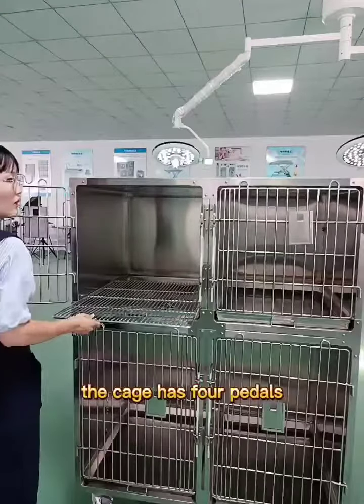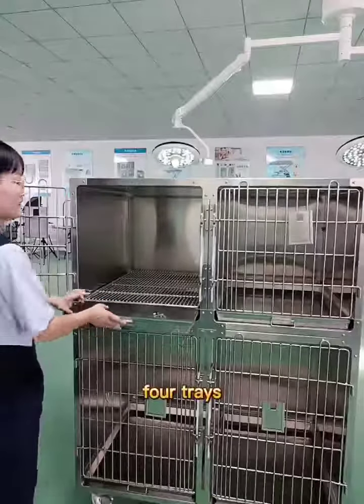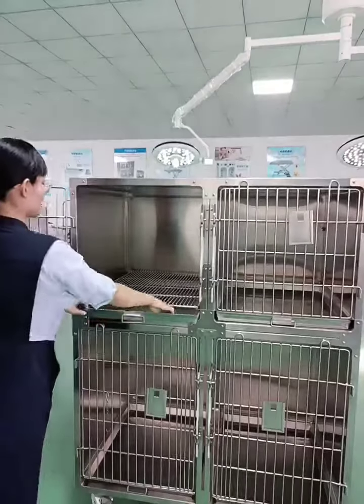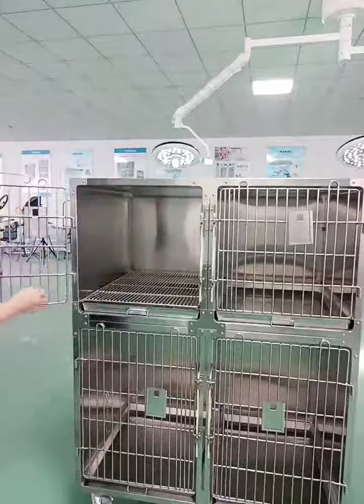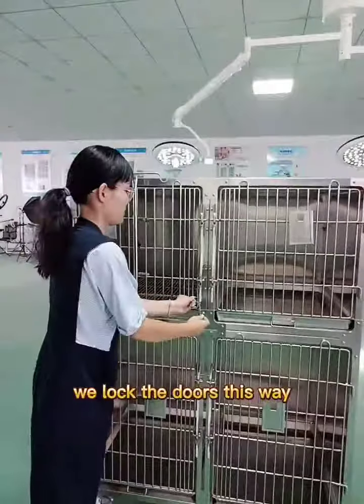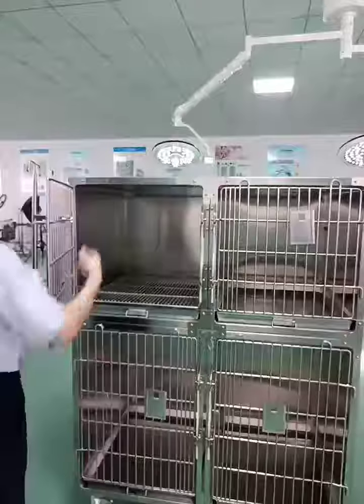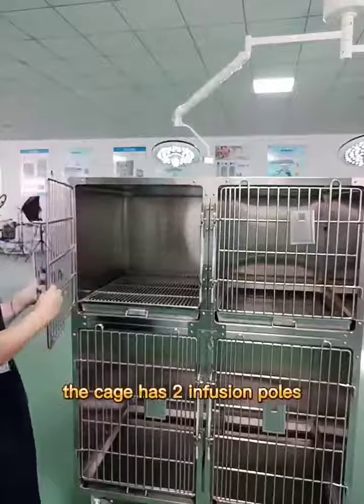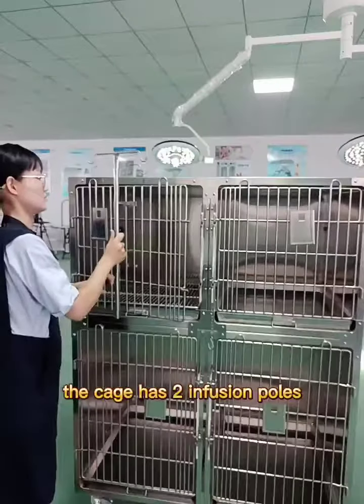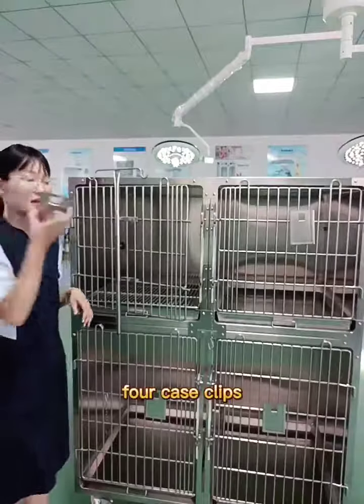The cage has 4 pedals and 4 trays. This is a lock — we lock the doors this way. The cage also has 2 infusion poles and 4 case clips.